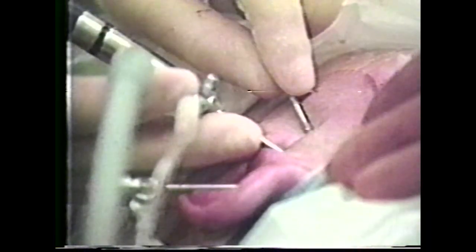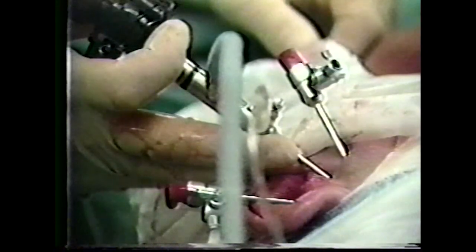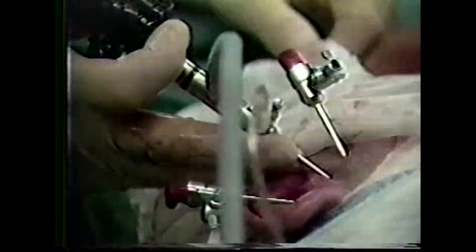The Endaural approach is indicated whenever clinical diagnosis would lead to the conclusion that a lateral synovial prolapse, plica, or adhesive capsulitis are present. Often these conditions are difficult to detect on MRI or arthrogram. Direct visualization may be the only way to confirm and treat the pathology. Also, the Endaural approach allows better access to the medial trough for the retrieval of loose bodies and broken instruments, as well as providing direct angulation for the instrumentation of medial and lateral structures if needed.